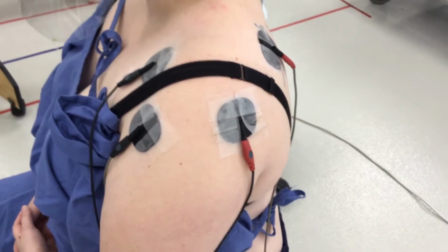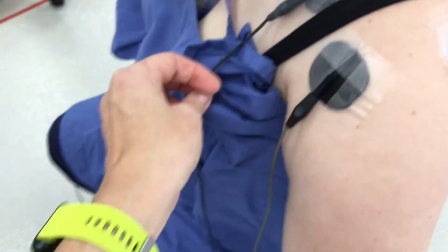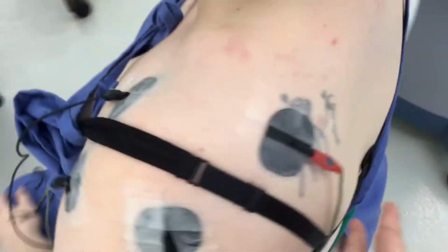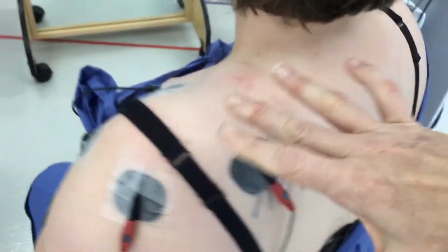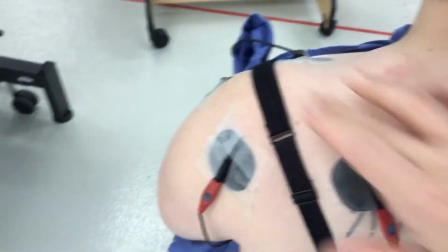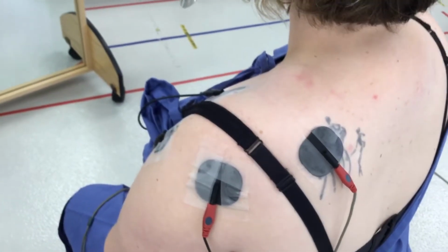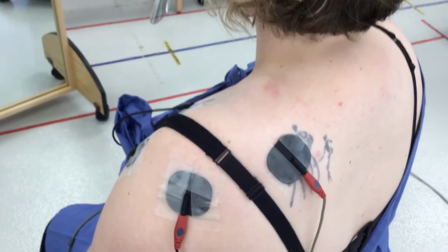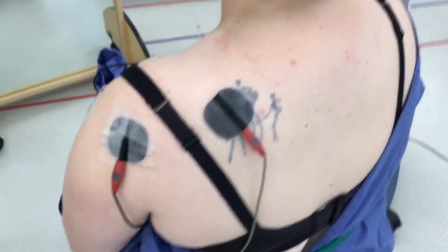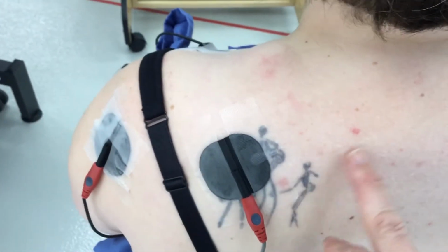to help manage pain within that area. Okay, so here we've set up 4 electrodes for our quadrupolar. You can see that here, black with black is crossing the channel with gray and gray. So there are 2 channels, one channel going this way and the other channel there. It's the crossing of those 2 currents that is going to have that interference for the interferential current. And so the effect is going to be deeper into the tissues, in the areas where those cross. One thing we've just made sure, we had a check of Layla's skin, and there are a couple little lesions, so we've stayed away from that.